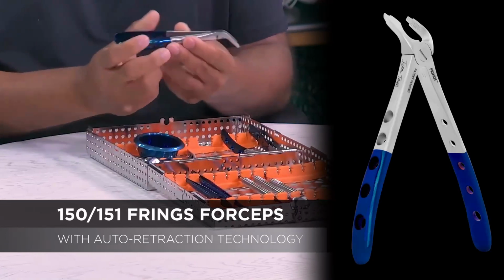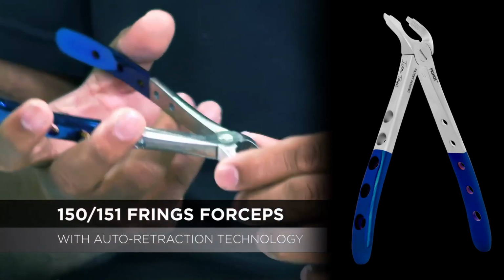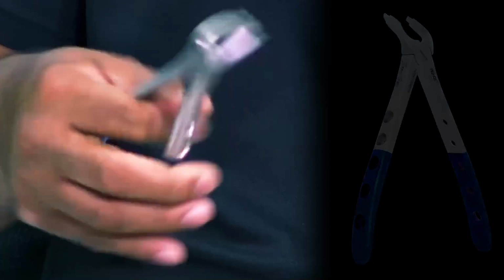As we continue, we have our universal forceps. We have the 151, 150, and what's unique about these are a product called the Frings. And what they have is a spring built into them, so you're not trying to open it like this. I hate when I get instruments and I have to figure out how to open them. So now we have something that we can open, we can squeeze. It really works nicely in your hands.